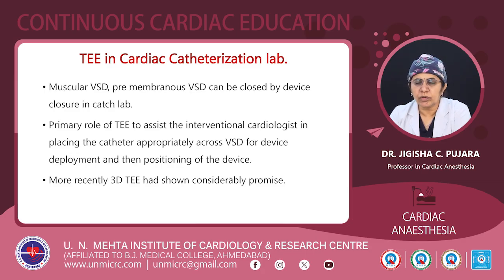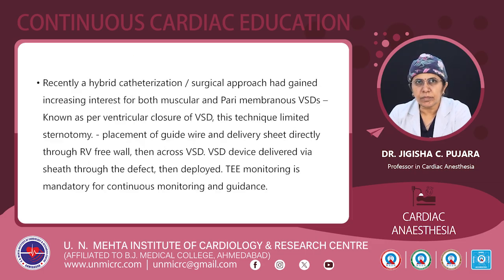So right from catheter insertion, passing accurately through the VSD, and device deployment, and once the device is in position, whether the device position is proper or not can also be very well guided by the TEE, and 3D particularly will help more in this scenario. More recently, 3D TEE has shown considerable promise here.